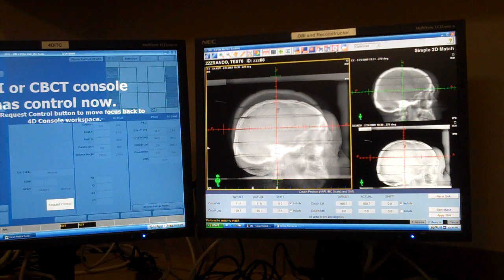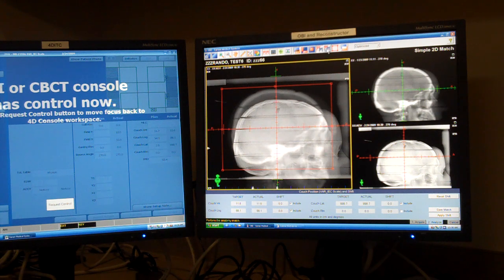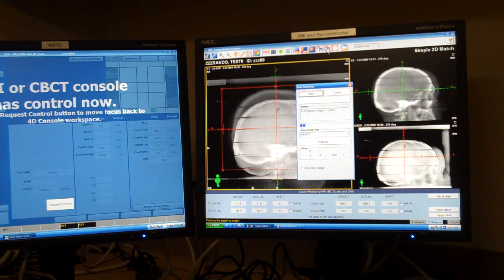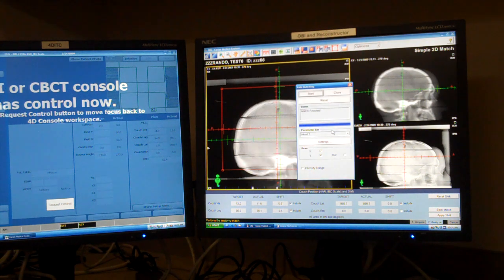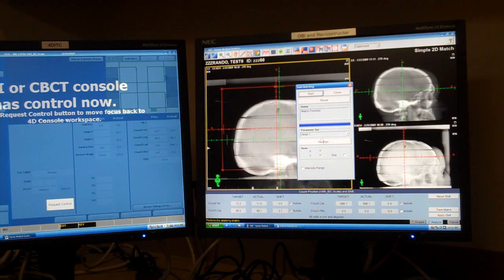You can select a region of interest — for this, we'll select the whole head — and do an auto-alignment. You can see it very quickly snaps into the right place.